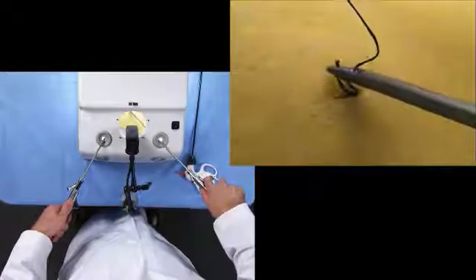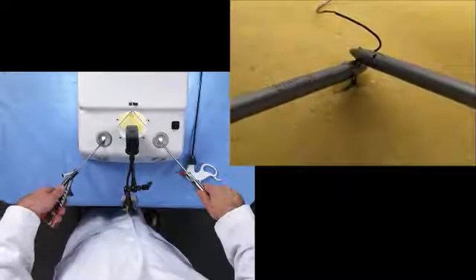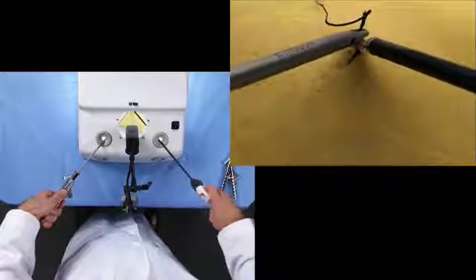We can then grasp both ends of the suture with the right hand. The left hand will re-grasp so the right hand surgeon can cut the suture with his right hand.